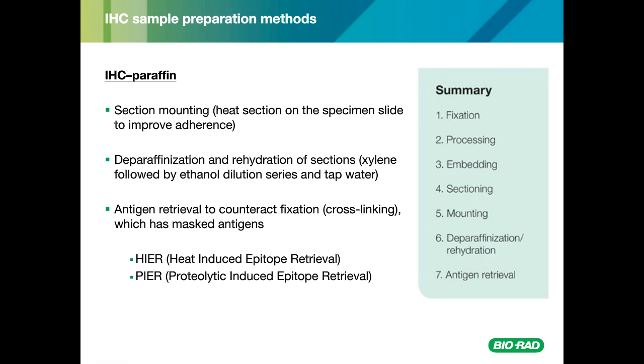Before the slides can be stained, antigen retrieval has to be performed in order to counteract the fixation or cross-linking step, which has masked the antigens. Two main retrieval methods exist. These are here, heat-induced epitope retrieval, and here, proteolytic-induced epitope retrieval.